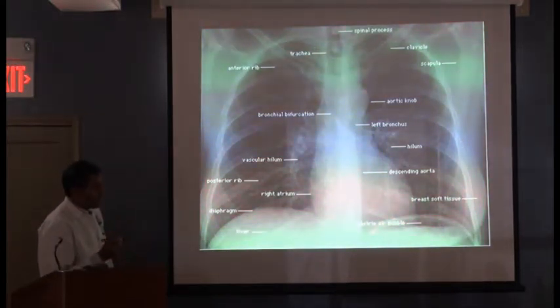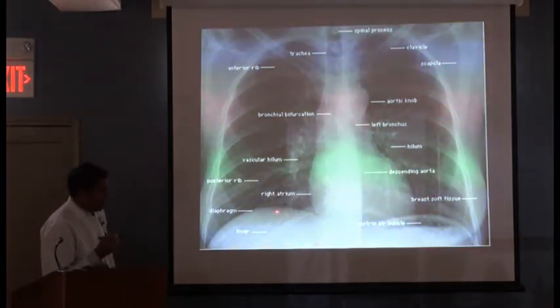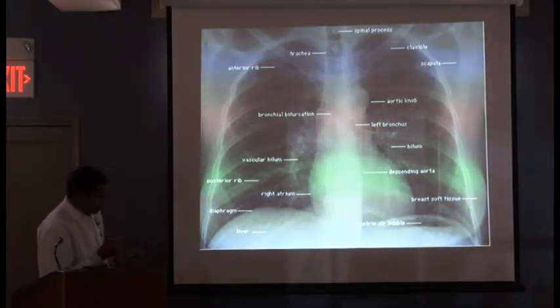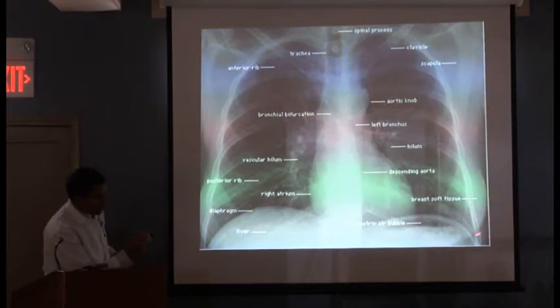Okay, D is diaphragm, so I'll look at the diaphragm right here. Very important because I can tell a couple of things, and I'll show you some examples. One is that we can see if there's fluid accumulating in the costophrenic angle. This is called the costophrenic angle. All right, costo meaning the ribs and then phrenic meaning the diaphragm.